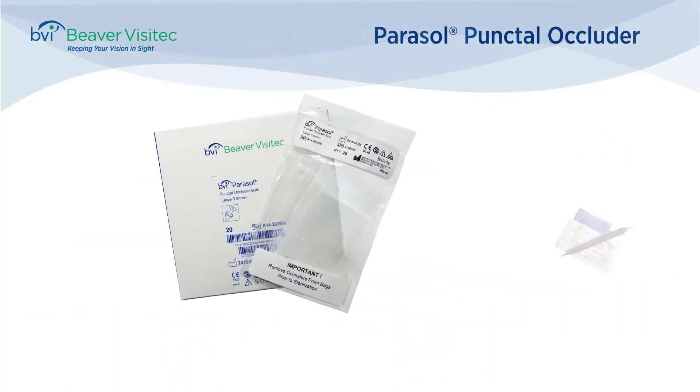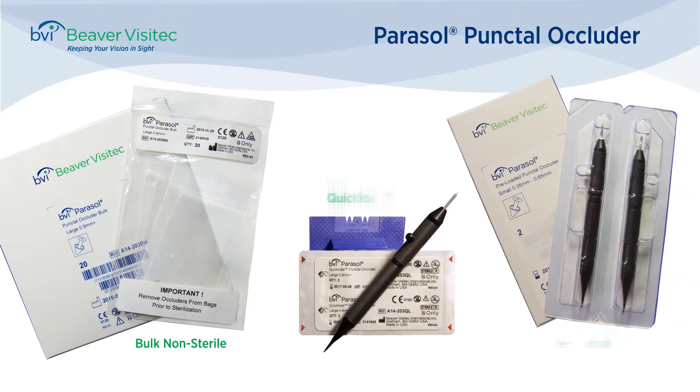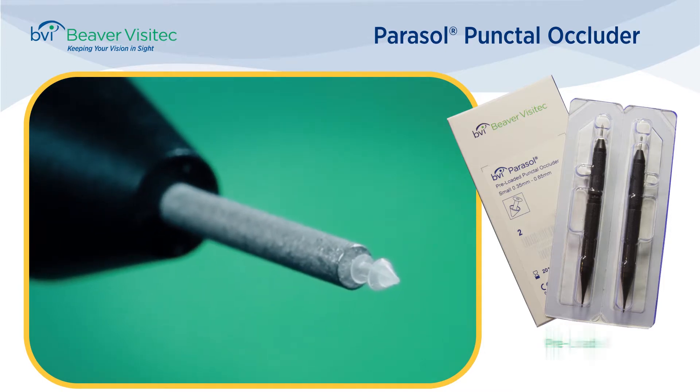There are three packaging configurations of the Parasol punctal plugs: bulk non-sterile poly bags, sterile quick-load packs, and sterile pre-load — which, as the name implies, come packaged with plugs pre-loaded and ready for insertion.